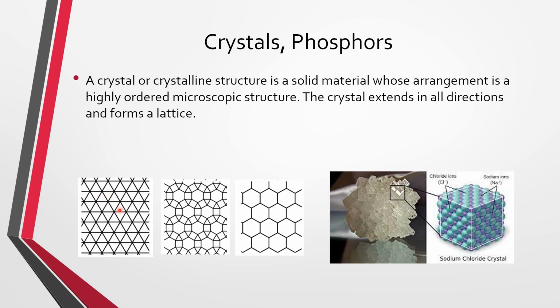Okay, it's a uniform shaping. And the atoms are actually formed in a uniform way, and that's how the F centers are created. Like it would be in between these areas, and it extends in all directions.